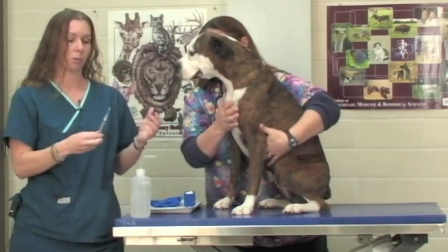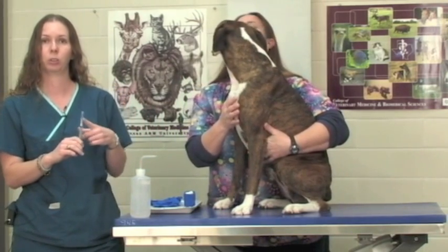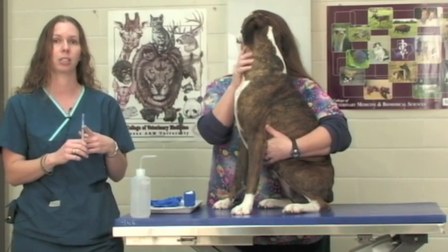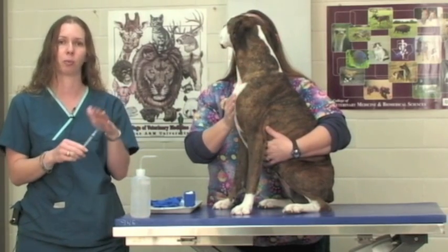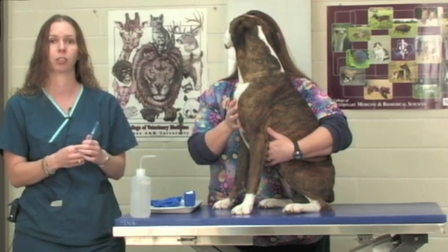For most intents and purposes a 22 gauge needle — most 22 gauge needles are blue on the cap — is going to be perfectly fine for drawing blood. If we have an especially small patient we may choose a smaller needle size, but for most purposes a 22 gauge needle is going to be perfectly fine for drawing blood.